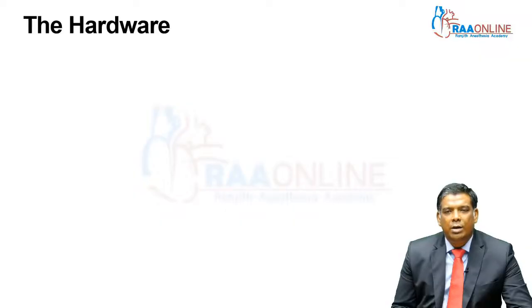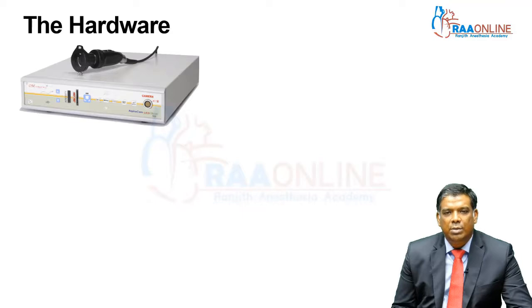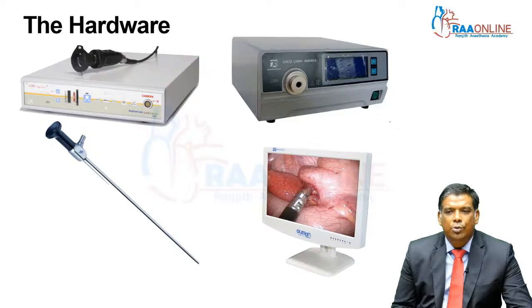So what are the hardware parts of the imaging system? You have what is known as the camera, then you have a light source, which is generally a cold light source, then you have the telescope, which we'll explain to you a little later, and you have a monitor, right?